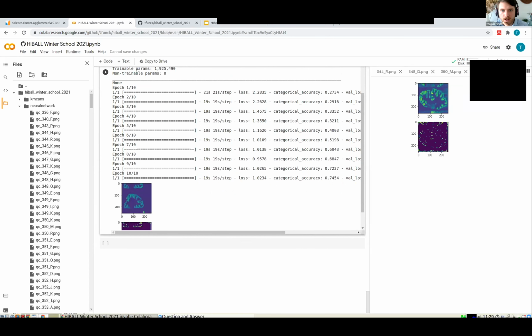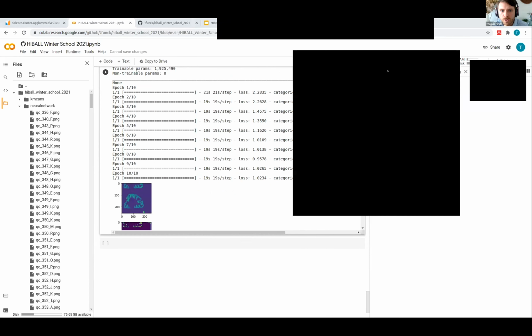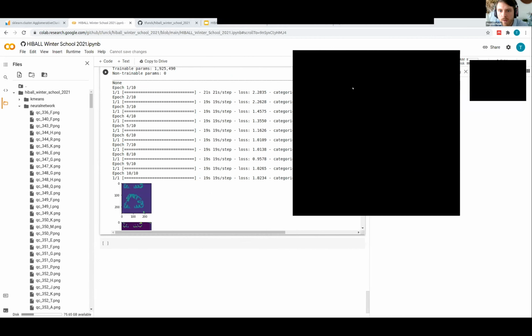Before we... oh, I have only a minute left. There are 2 questions. So will the network be better than k-means? Yeah. Because k-means will pick up artifacts or things that shouldn't be in your segmentation. If you get rid of those manually and then you retrain the model, then it will be better because it'll have learned to ignore those things that k-means would otherwise pick up incorrectly.